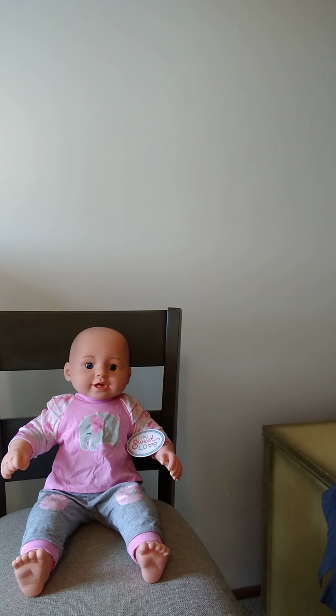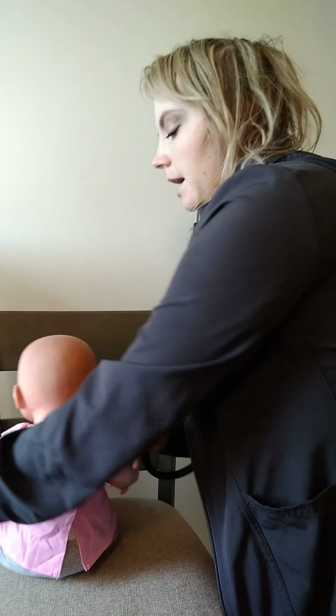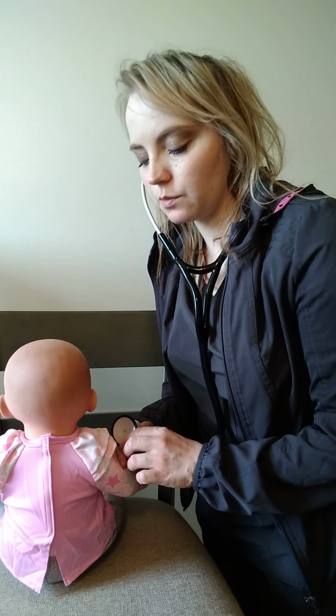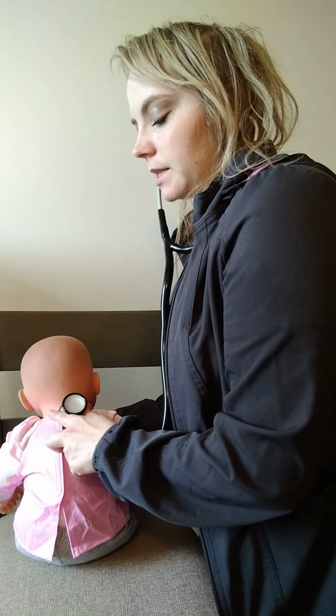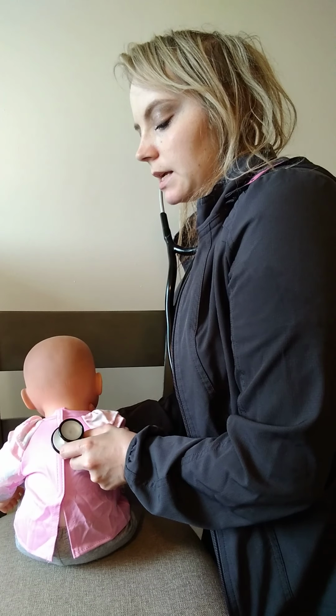And then on the posterior side, you want to make sure you're not listening over the scapula, because obviously you're not going to be able to hear it too well. So I'm going to start up at the top here and go on both sides. Then you go around both the scapulas on each side.